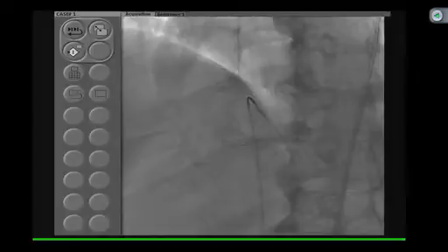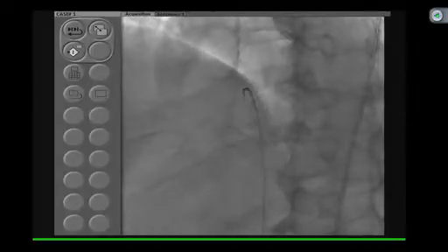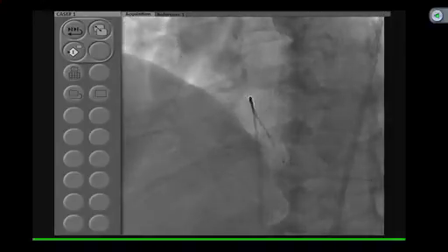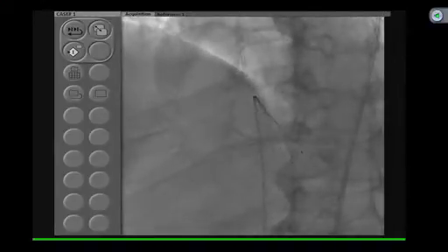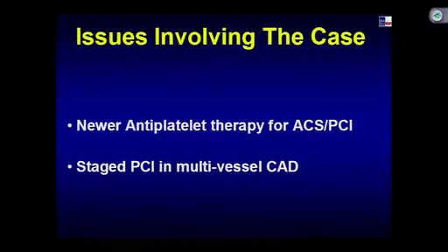Yeah, absolutely. Samin, take us through what you have in mind, and I believe you are going to cover the very critical important issue of staging. Yes, clearly that if we can go back to the slides now, and again we try to make, you continue your rota wire. I wanted to show a point. Okay, now before we go on, we can go to fluoro again, 1 second.